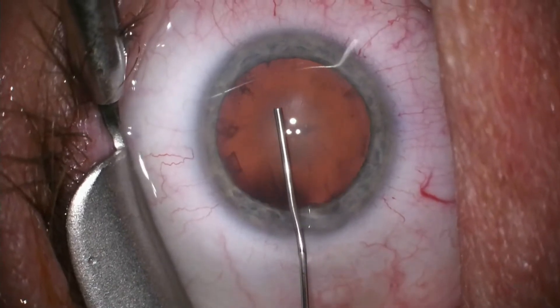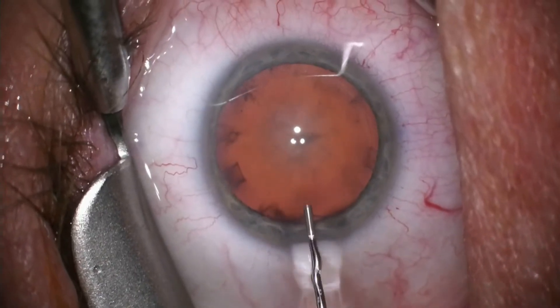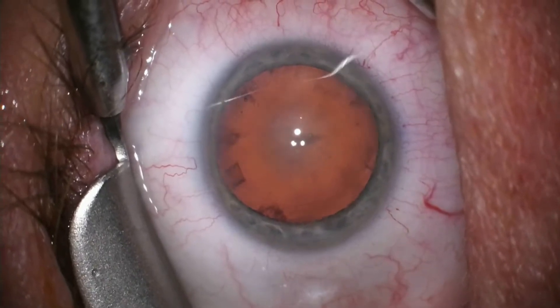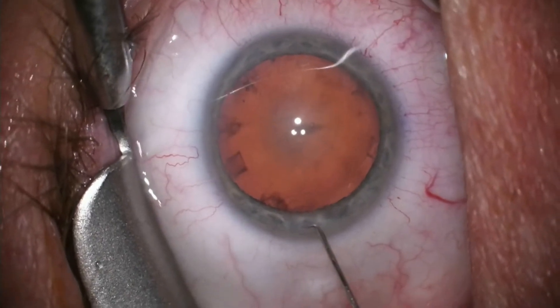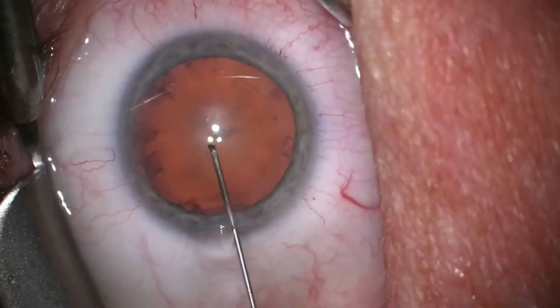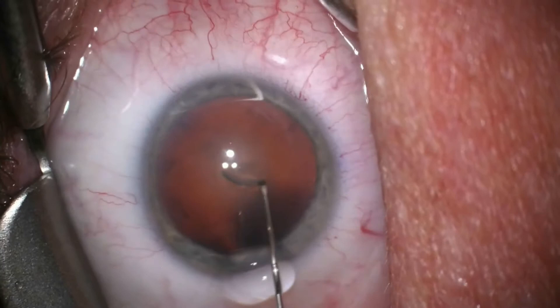A viscous gel is then inserted between the cornea and the cataract below it. As you can see, the pupil is widely dilated, and this allows us to see the hazy cataract against the red reflex of the retina.